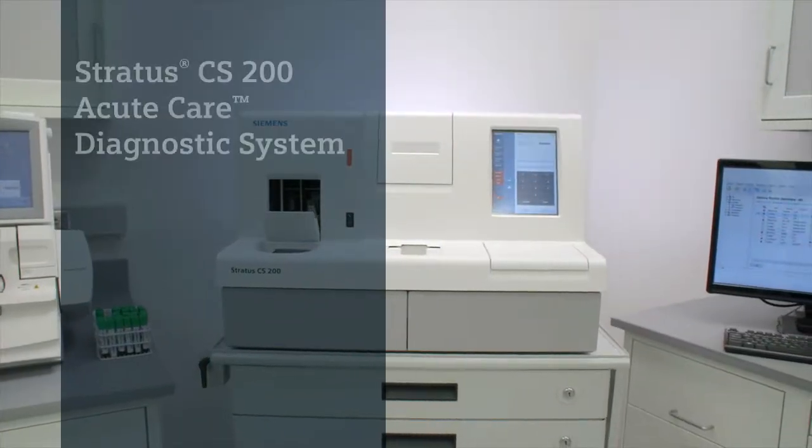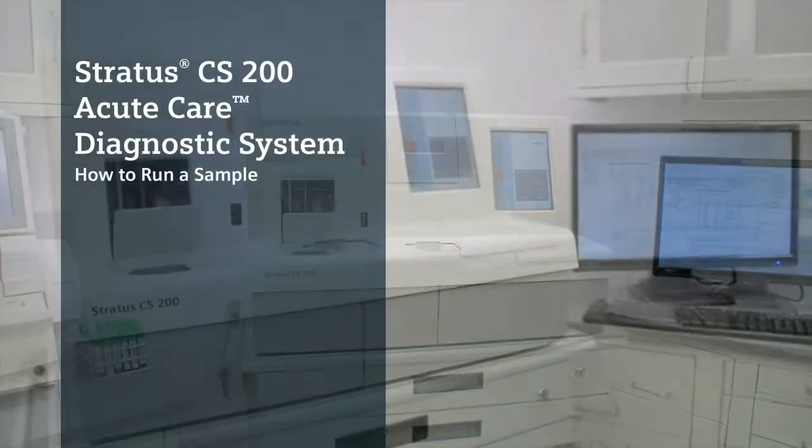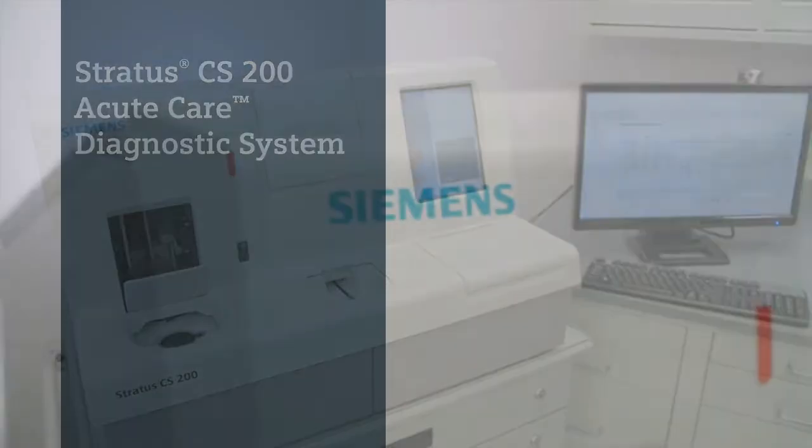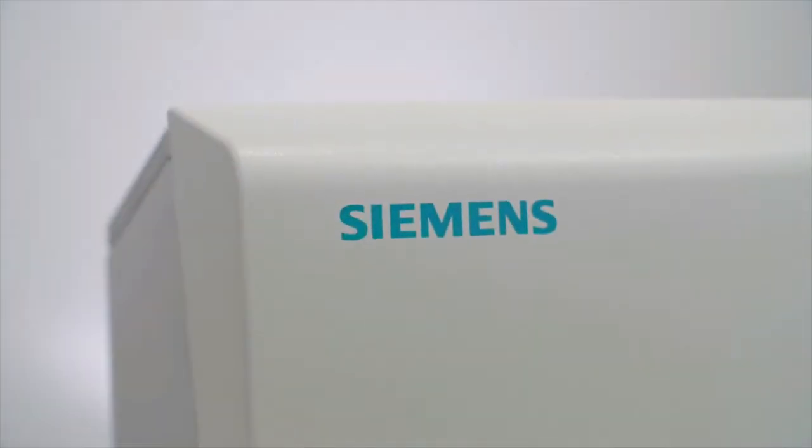Running a patient sample is fast, easy, and customizable. The system accepts 4 milliliters of whole blood in a lithium or sodium heparin collection tube.